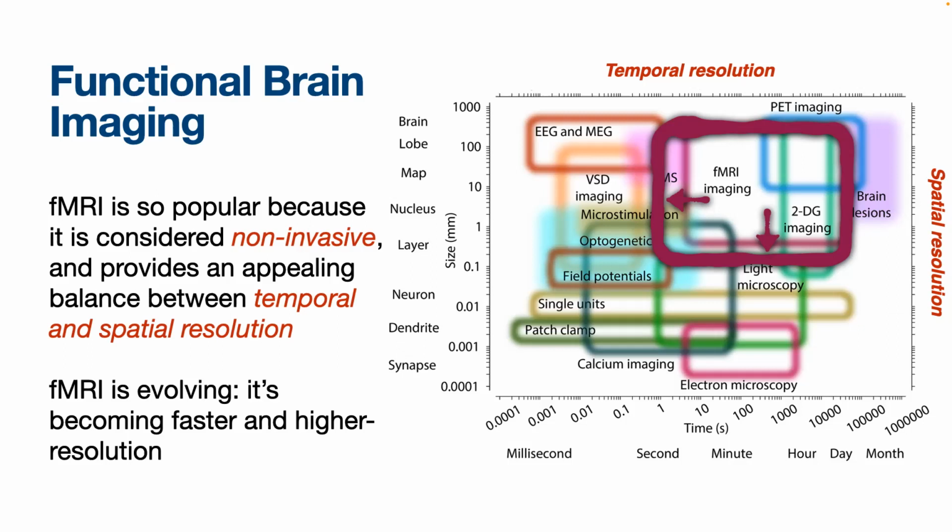There's also a limitation, of course. Can anyone think of a limitation, a sort of experiment that you just shouldn't do? So fMRI would be really bad if you're interested in fill in the blank. Movement. That's an excellent, very good point. You have to be still. I don't know who said it. Oh, there you are. Indeed, keeping people still is a major downside of fMRI.